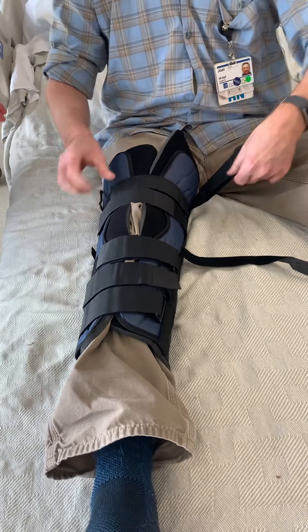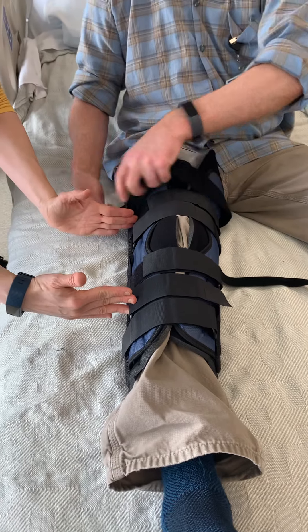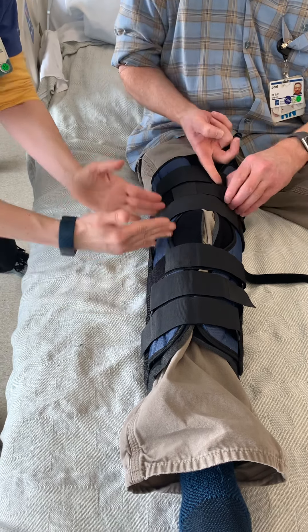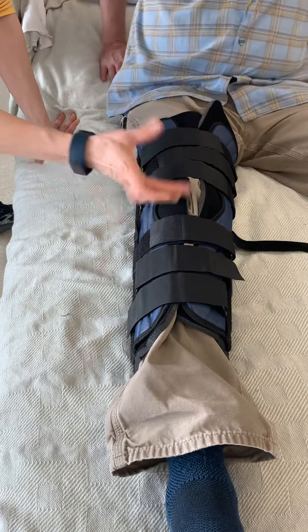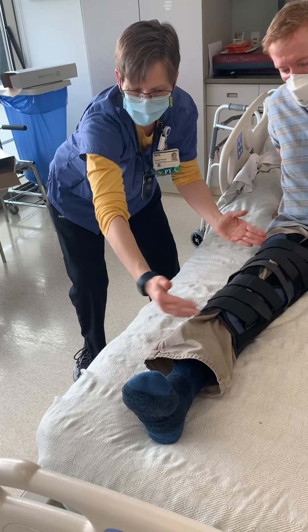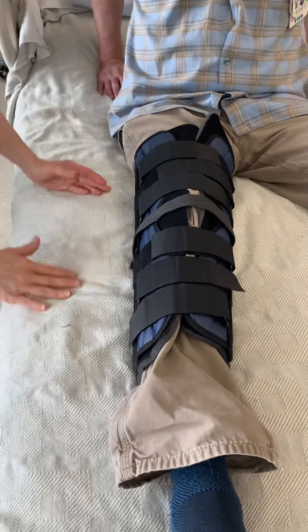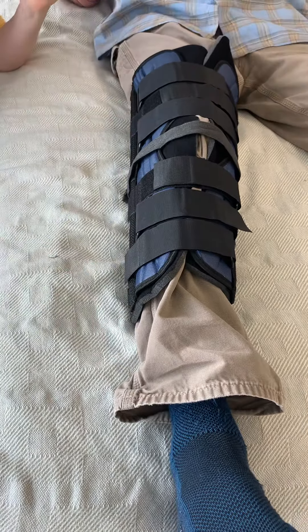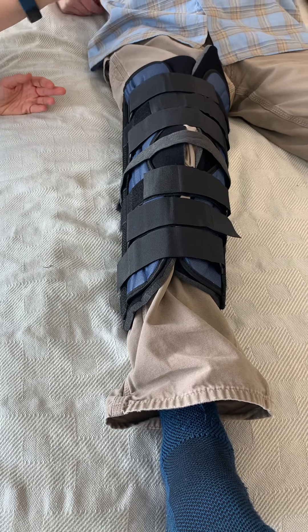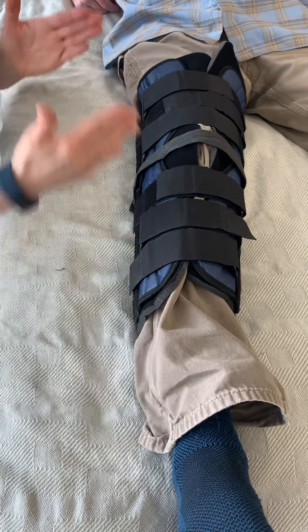Usually we've got three straps up top and three below. These braces come in at least three different sizes in the storeroom. They've got a little itty bitty size that's pretty rare you'd need. You want it long enough so that, say, if they had a patella fracture, you'd want enough length on the immobilizer so that it's not letting the knee bend. If you got just a little short immobilizer on someone his size, it's not going to work. Generally, if you have to figure out how long to make it, you're measuring roughly from just below the groin down to about where the malleolus is.